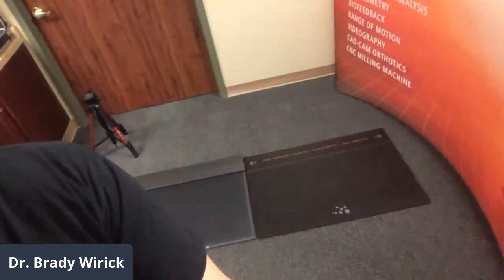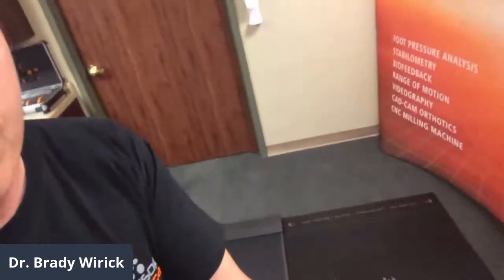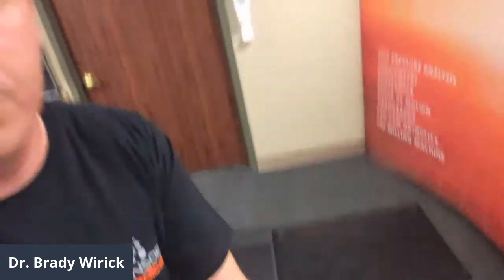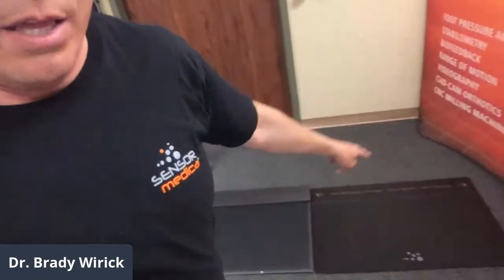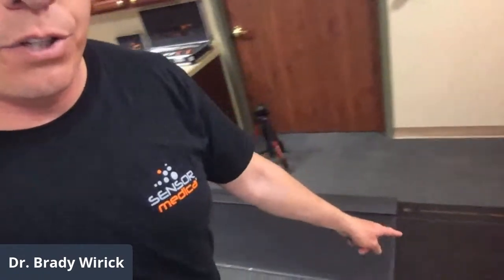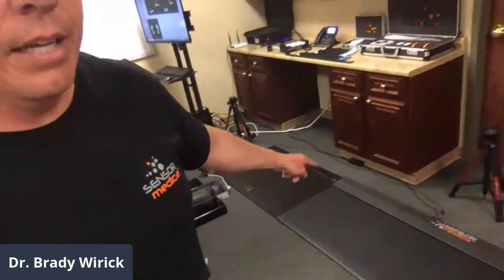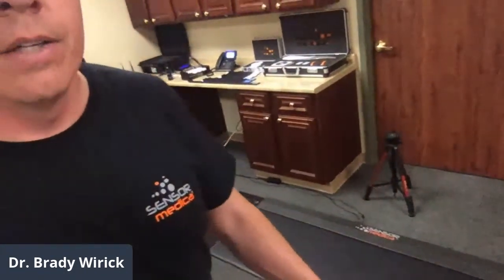I'm going to carry the laptop around. So that's the platform right there. They start on this particular side here, and there are no sensors in that piece right there. That's just a platform for them to start on. The sensor starts here. She walked across that platform, got to the other side, turned around, and came back. I usually have people do that about 5 times so that we have a good average.